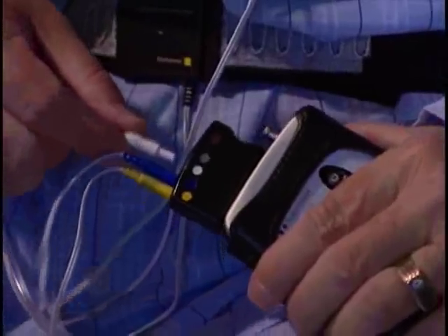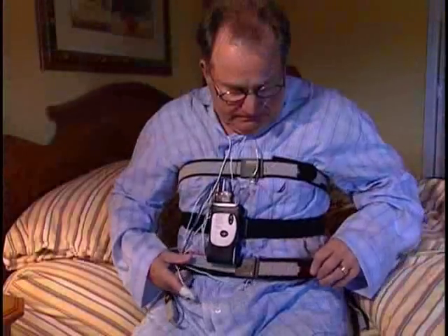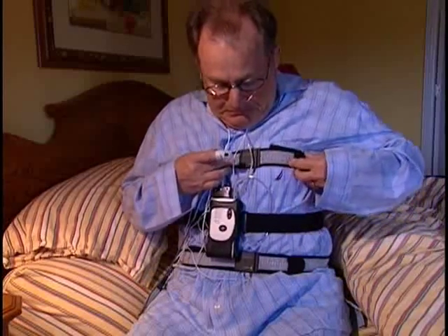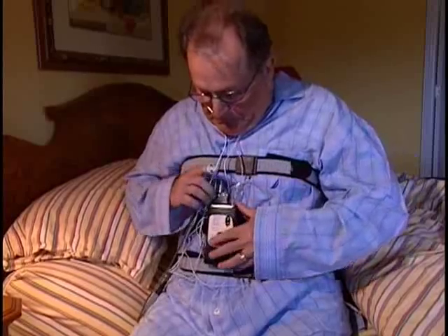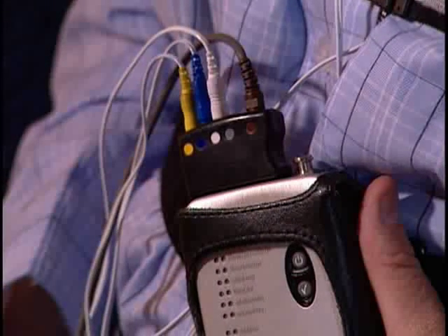Your Embletta provider may have already connected some of the sensors to the Embletta proxy for you. If one of the sensors has disconnected, simply reconnect using the color-coded inputs. Before going to bed, you will want to check a few things in order to ensure a successful sleep study. Please check that the sensors are placed correctly on your body. Check that the sensors are firmly connected to the proxy. Plug the sensor proxy into the Embletta device with the colored spots facing towards the front. You will hear a beep and the device will power up. Be careful not to put pressure on the sensor wires or connectors.